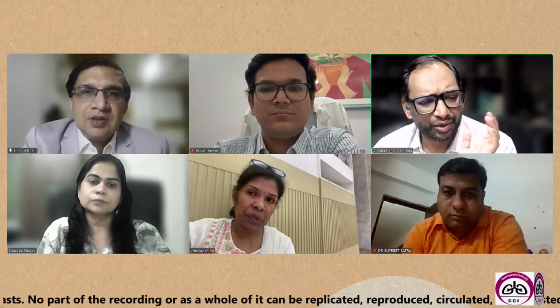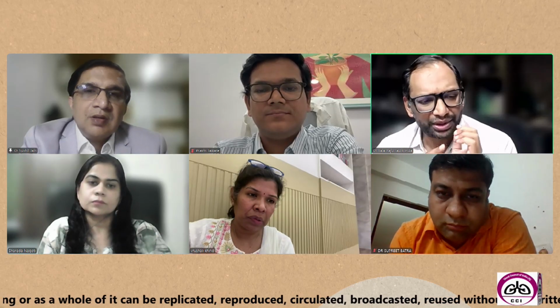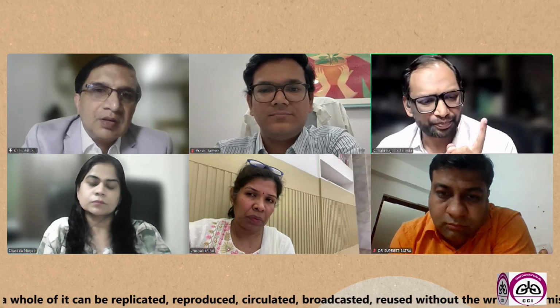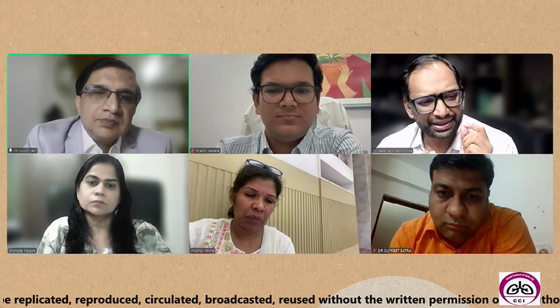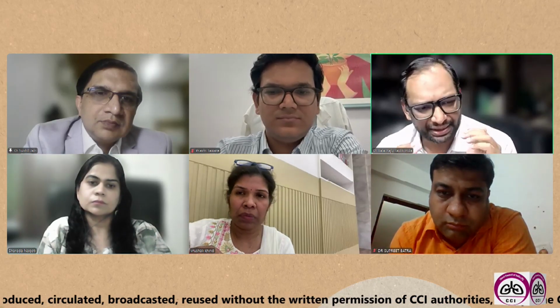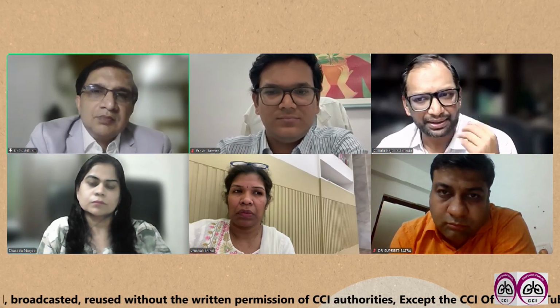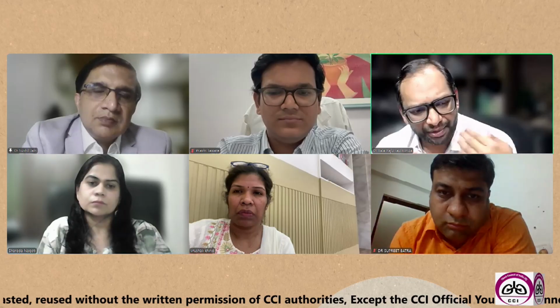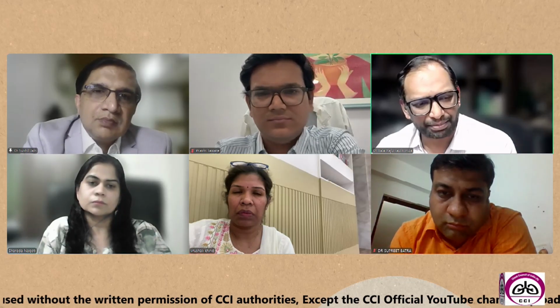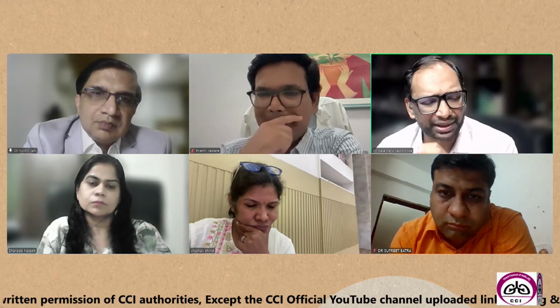I just want your opinion regarding this because I had this problem when I was doing a saline sample. I usually used to do only one or two passes in the saline sample. What I've seen is the chances of getting a GeneXpert positivity drastically decreases if you use one sample. That's what I have seen in my practice. So now I started doing more passes in the saline sample if you really want to get a good GeneXpert positive. I just want to know your experience regarding that.